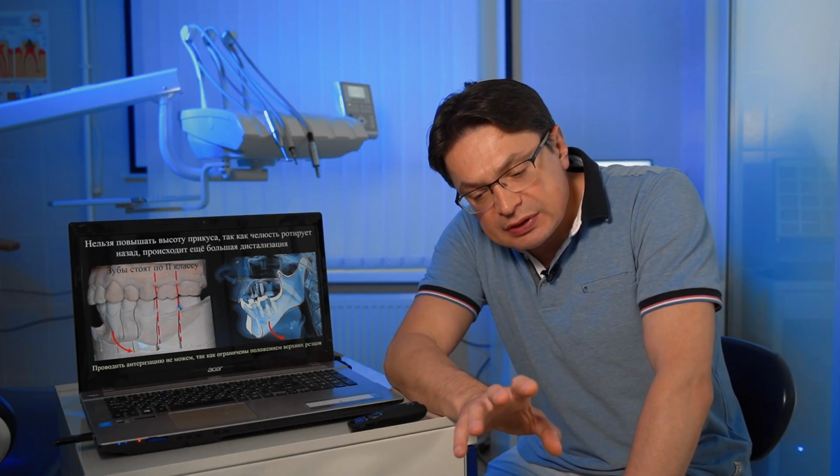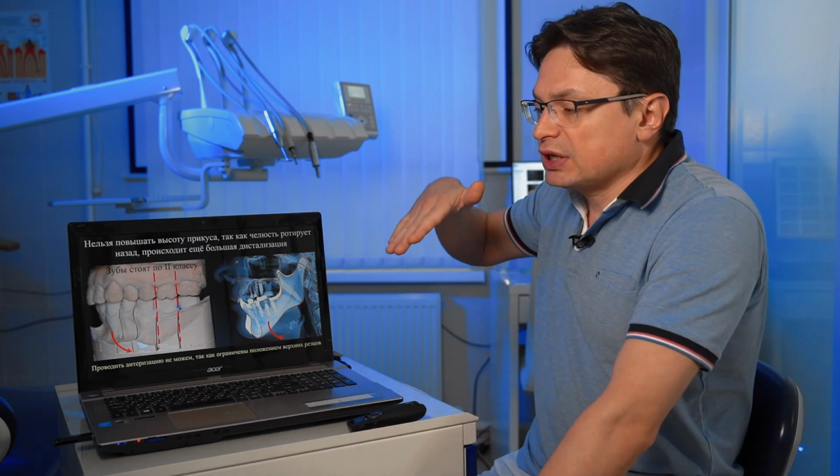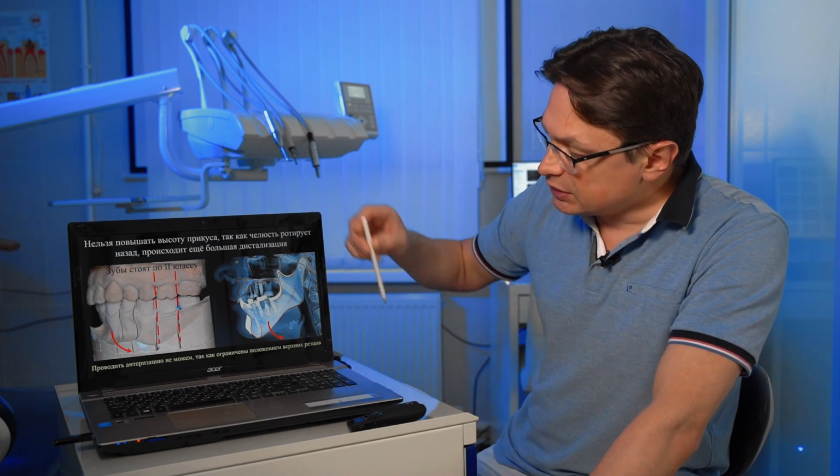Why am I talking about this now? Because for us, the first stage, a pre-prosthetic treatment, is a highly important stage. We cannot immediately proceed to the permanent and even temporary prosthetics in patients with pains and intra-articular damage. We have to work out a certain treatment conception with the use of splint therapy. What does the splint do? It increases the bite height.